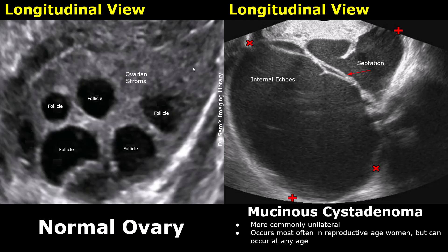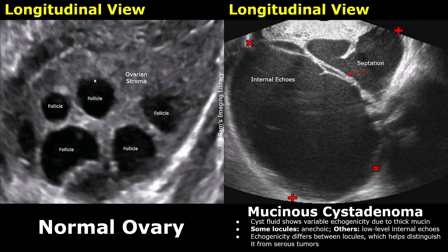These are all transvaginal images. On the left is a normal ovary in the longitudinal plane. This homogeneous area is the ovarian stroma, and we can also see anechoic ovarian follicles — five of them in this image.